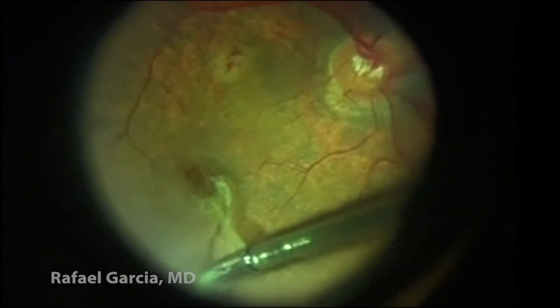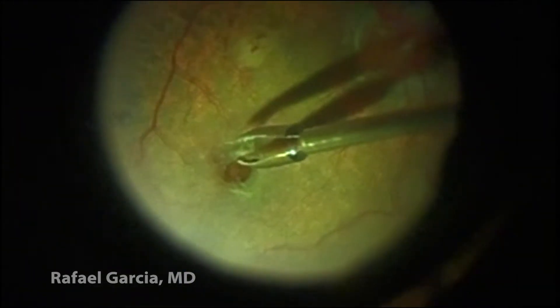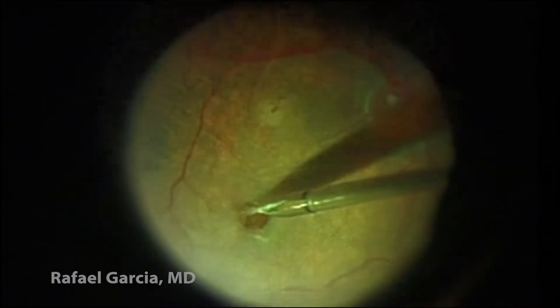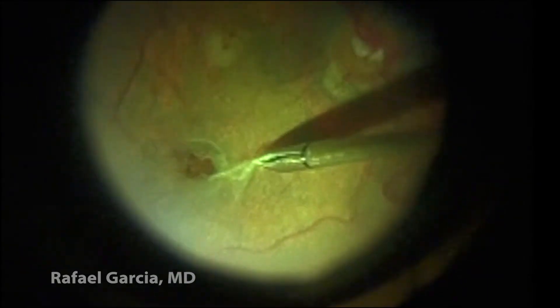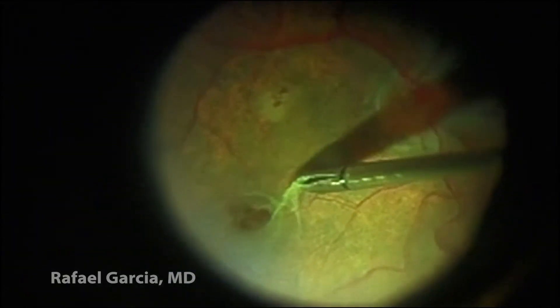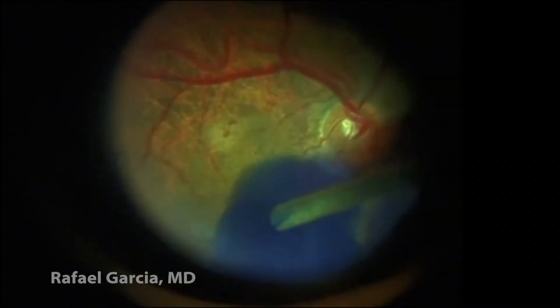In this case, there's a thick and sticky membrane all over the macula, so we carefully remove it, paying special attention to the borders of the hole. We don't want to put too much traction on its edges in order to avoid intraoperative complications. So, nice and easy, this adherent epiretinal membrane is successfully peeled off.